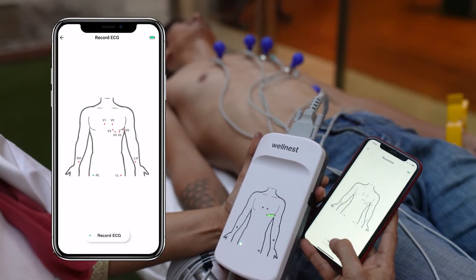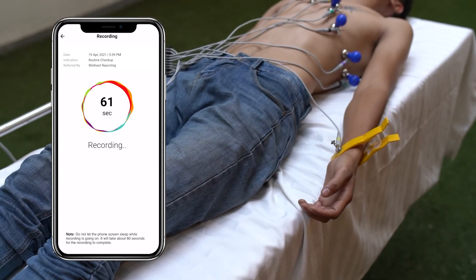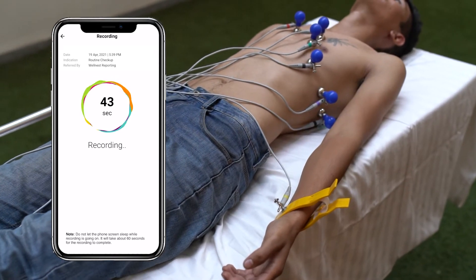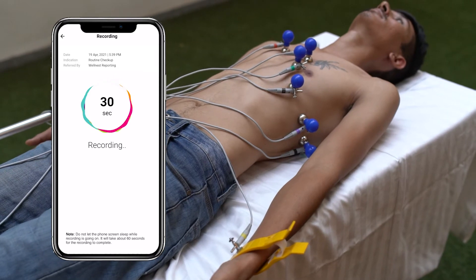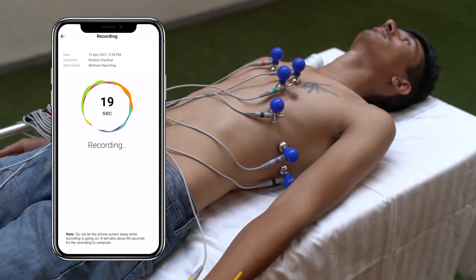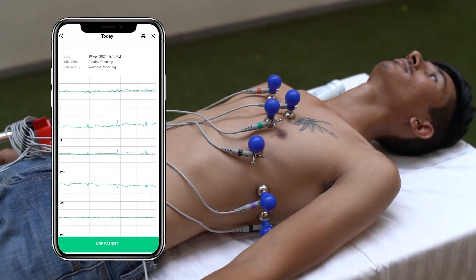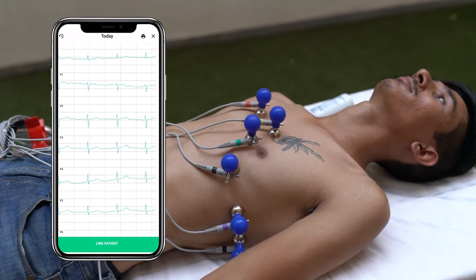Click on Record ECG and the countdown will begin. Ensure that the patient is relaxed and does not strain their muscles. Ask them not to move or talk during the first 15 seconds of the assessment. It takes about 30 seconds on Android and 60 seconds on iOS devices to complete the process. At the end of the countdown, you should be able to view an accurate and medical-grade 12-lead ECG recording with auto-measured values.